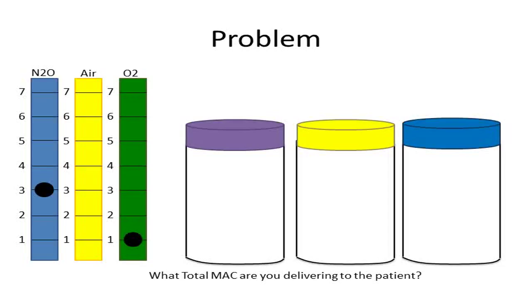If I increase FiO2 by increasing up, I just want to make sure. If you have an increased FiO2, you're going to increase your oxygen, not increase your nitrous, and you'll use something else that you have. Because I'm going to lose my MAC. That's all right, but that's part of it. If you know that you've got to adjust something on your flows and it's going to alter the concentration of agent you're giving, either the patient needs it or the patient doesn't need it. And plus, remember, you're not to the point where you've got other things that you can give. You're learning this by itself. But you're absolutely right.